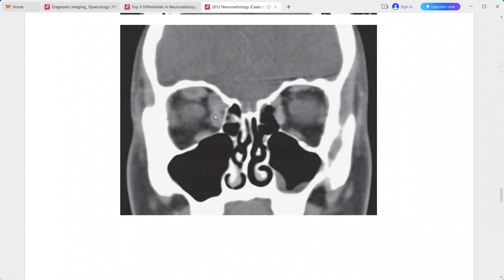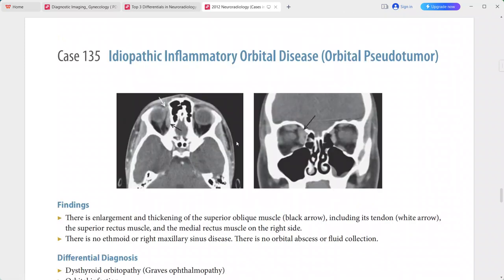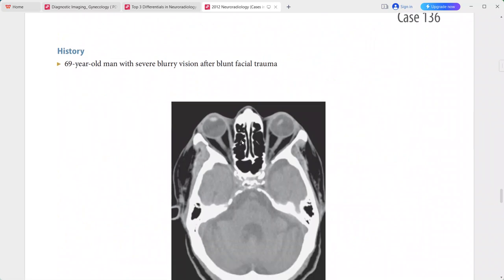There is no ethmoid or right maxillary sinus disease, and no orbital abscess or fluid collection. This is the typical imaging picture of idiopathic inflammatory orbital disease, called orbital pseudotumor. Differentials include thyroid ophthalmopathy or Graves' ophthalmopathy, orbital infection, lymphoproliferative disorders such as lymphoma, and inflammatory disorders like Wegener's granulomatosis or sarcoidosis.